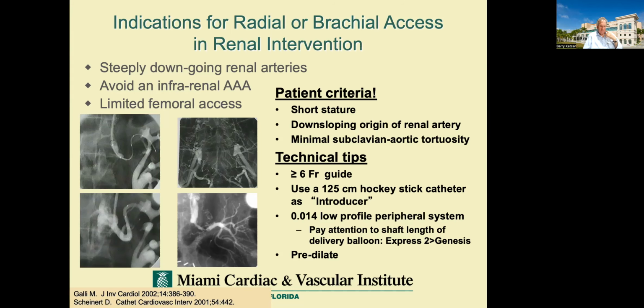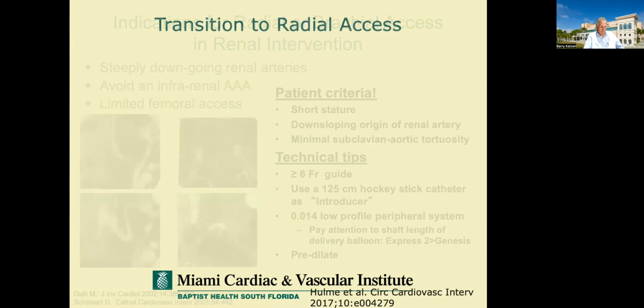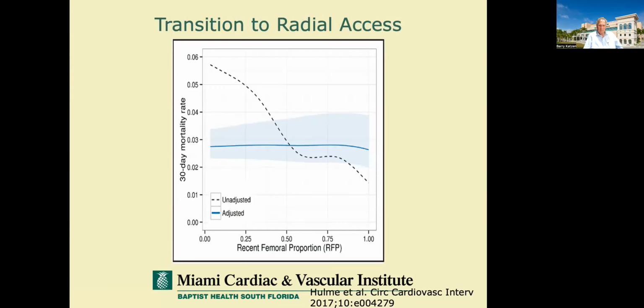It's somewhat easier to come from above. Also, in patients like this whose iliac arteries are occluded, it's technically easier to come from above. There are basically two technical ways to do this: the so-called coronary way, where we put a guiding catheter in and use smaller catheters and balloons to cross the lesion, and then the traditional one where we just use a regular guide wire across the lesion and then use a balloon.